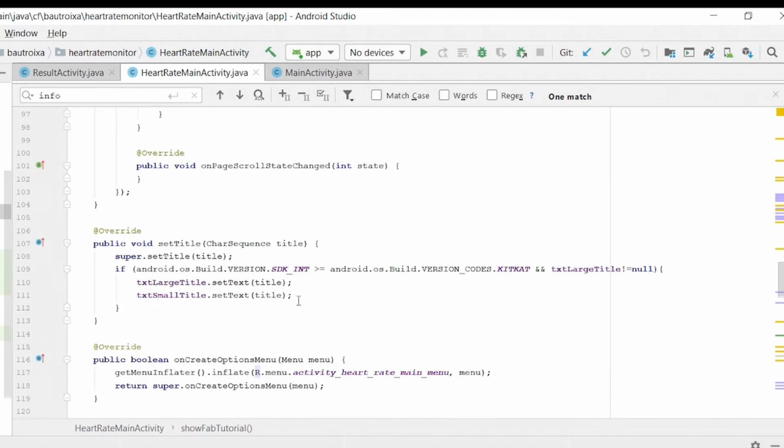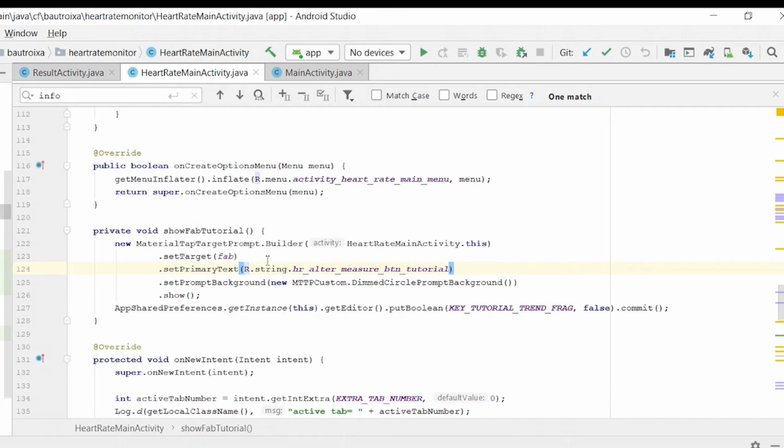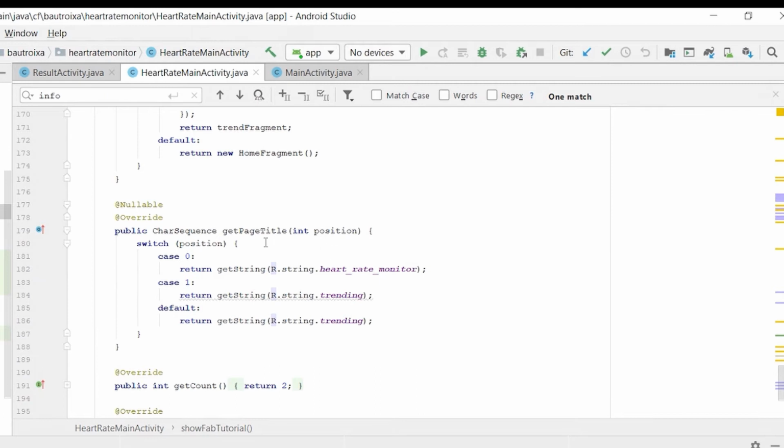Now here the show tab function says the button at the bottom of the application helps us to measure the heart rate if we just click on it. Now moving to the bottom, we can see the titles are assigned accordingly in the switch case function. So the switch case one says the heart rate while the second one says the trend, and so on accordingly.